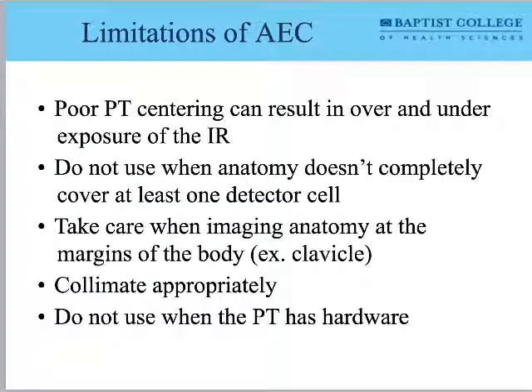Well, let's look at this other image up above it. We have an off-centering of what looks like a lumbar spine. The lumbar spine wasn't centered for this image over the photocell, so the photocell is partially uncovered. How would we expect this radiograph to appear?